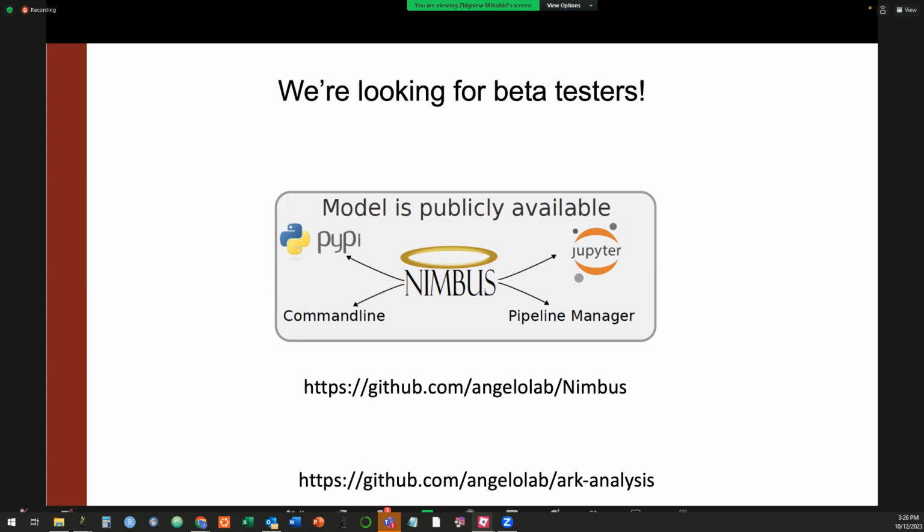That's option one. Option two is just take your 2D slices and stitch them together, and probably that'll be good enough. And at least it's going to be many years less work to do. So I would definitely encourage people to try that one first, and only if it doesn't work, think about doing the 3D model. Right now, the Mesmer model will not learn based on one stack, change its prediction on another stack. But if you have good enough performance and you're okay with some error rate, then that seems to work pretty well.